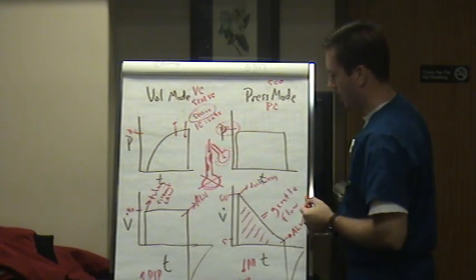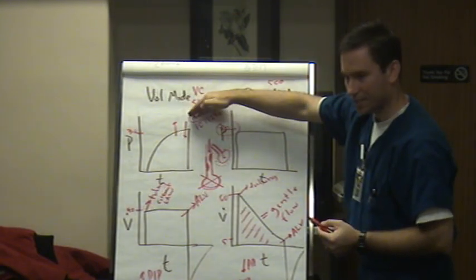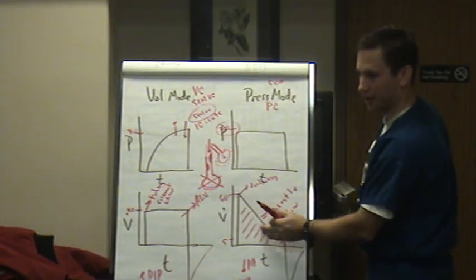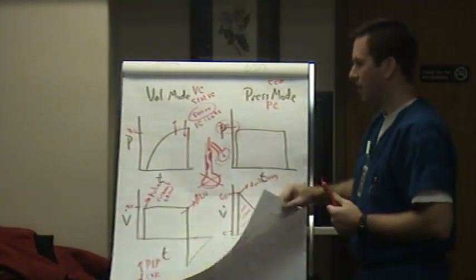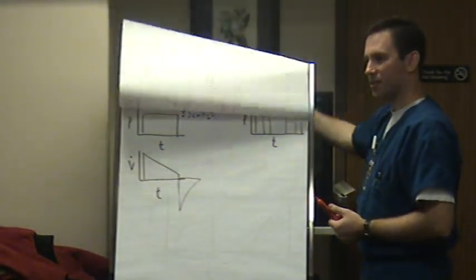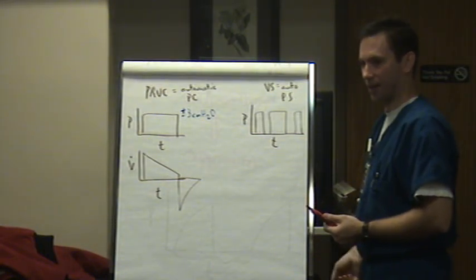Volume with the gentle flow. Very good. You get this over here off this side, but you get it delivered in this mechanism. And that's what makes it nice. That's why almost every patient, if their peak pressures are high in SIMV, if we do flip them over to PRVC, their peaks will come down if they're not fighting the vent.